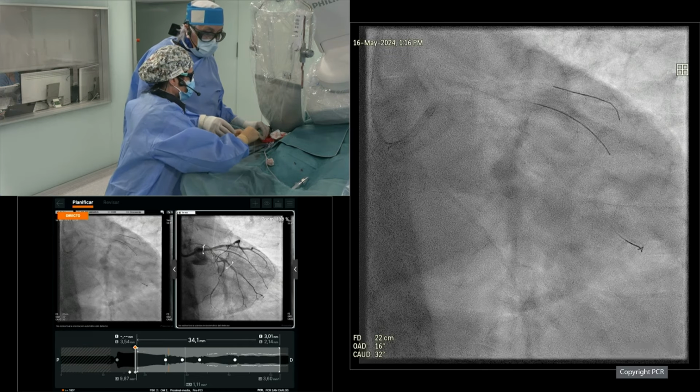I also noticed, Javier, that you resisted the temptation to do an angio control. That's what many of us would do after having placed the stent, just to make sure that we didn't have plaque shift. But I guess you rely upon the findings you just mentioned and the patient's symptoms. Now the patient is okay, so you don't anticipate anything wrong. Yeah, exactly. As you know, Nieves and I champion the importance of reducing operator dependence on contrast opacification, what we call ultra-low contrast PCI. And this is something that we apply routinely in all our cases.